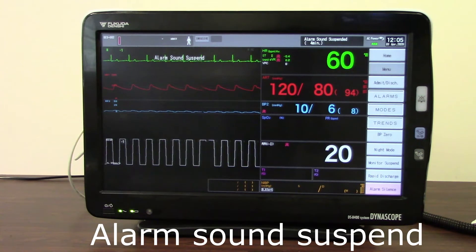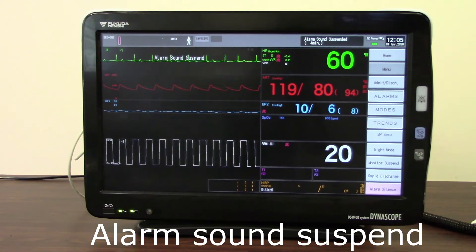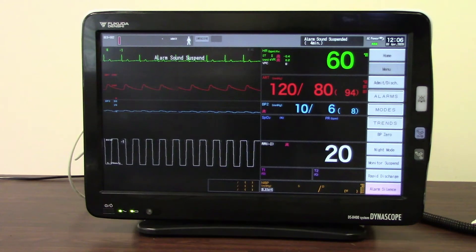So definitely not the kind of button that you're going to press and walk away, because during this time nothing at all will alarm. But it can be very useful if you're with the patient — rolling them, performing suction, performing any kind of procedure, or in the middle of a cardiac arrest situation where you just want to quiet the monitor down and not have any noise from it at all, but still be with the patient and able to see the monitor.